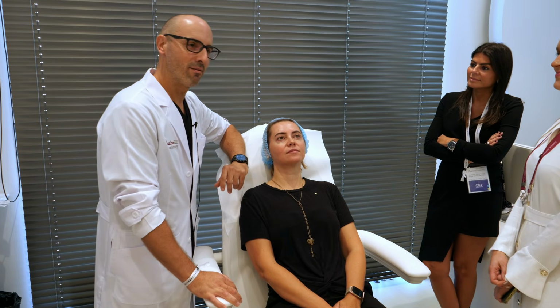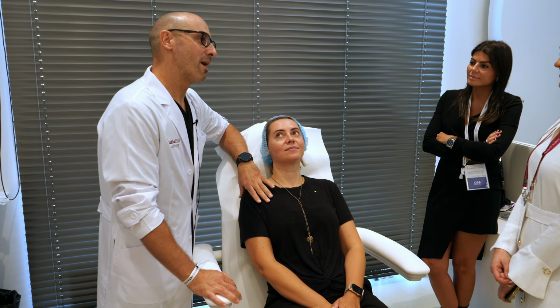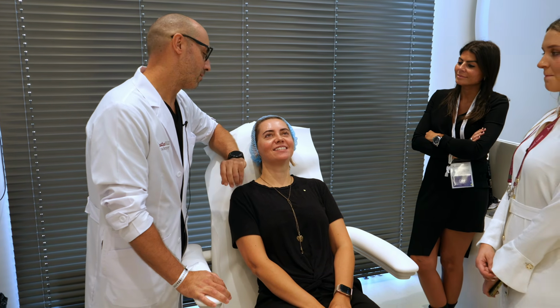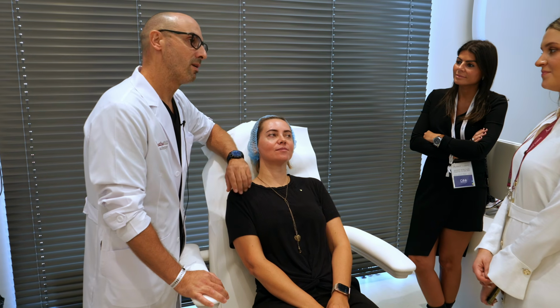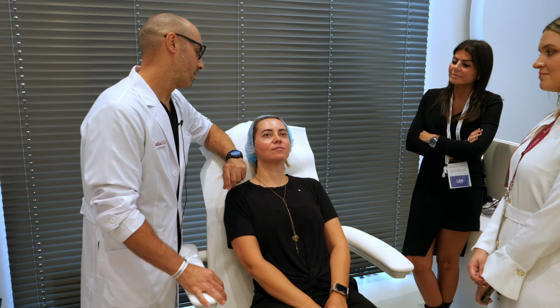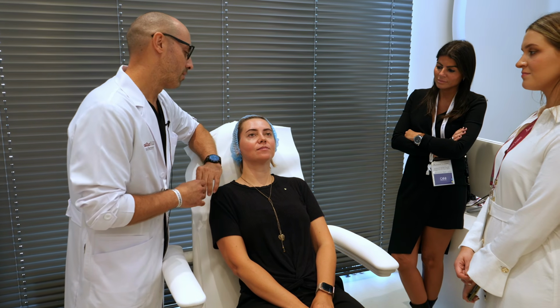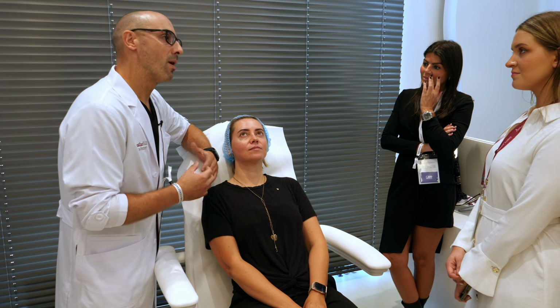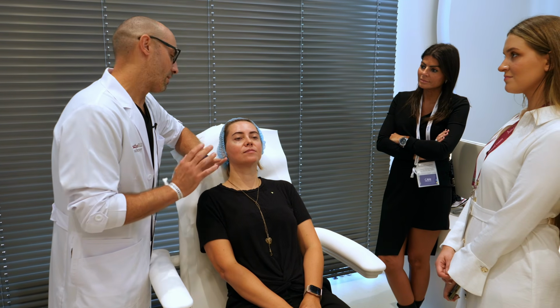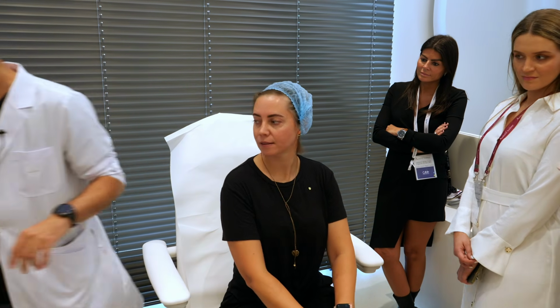I came from Madrid and I'm an aesthetic doctor, and she is Maya, the perfect patient for me. And we are beginning the treatment. First, I'll explain why she wants this treatment with polylactic acid, and how I make the entry points and the treatment areas. Okay? First, you can sit, vertical sit.